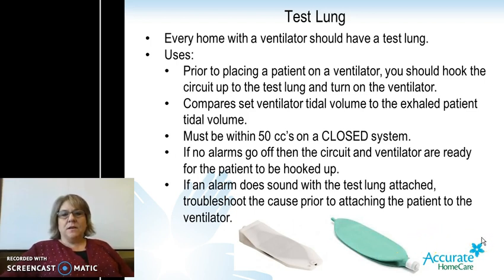The use for this test lung is, prior to placing a patient on a ventilator, you should hook the circuit up to the test lung and turn on the ventilator. It will compare the set ventilator tidal volume to the exhaled patient tidal volume, and it should be within 50 cc's, again on a closed system. This is considered a closed system because it has a constant known volume. If no alarms are going off, then the circuit and the ventilator are ready for the patient to be hooked up. If an alarm does sound with the test lung attached, troubleshoot the cause prior to attaching the patient to the ventilator.